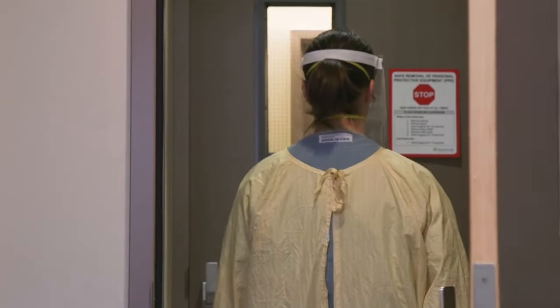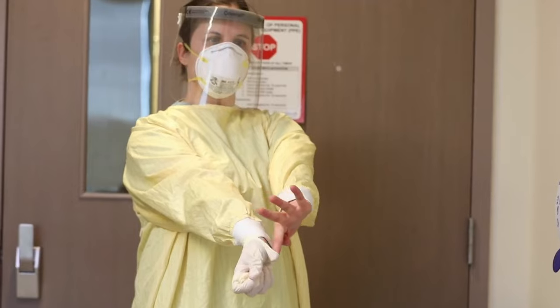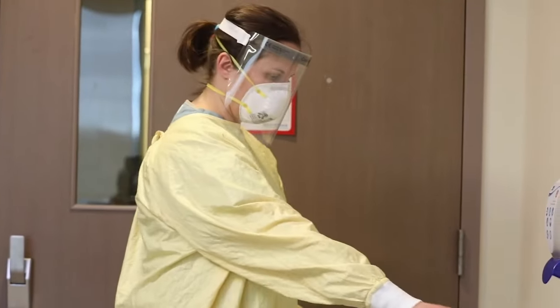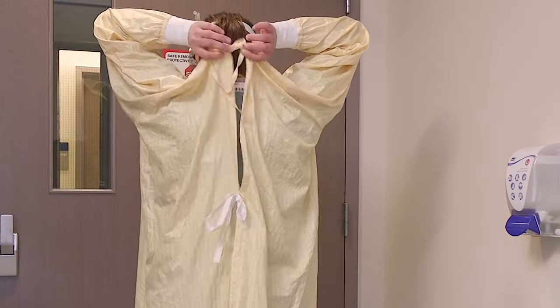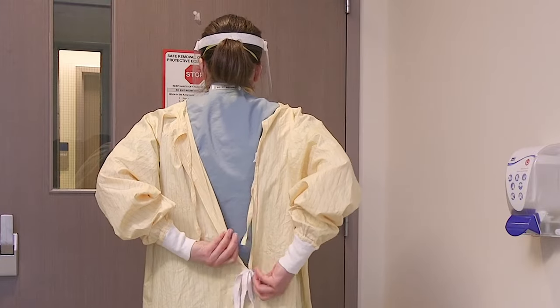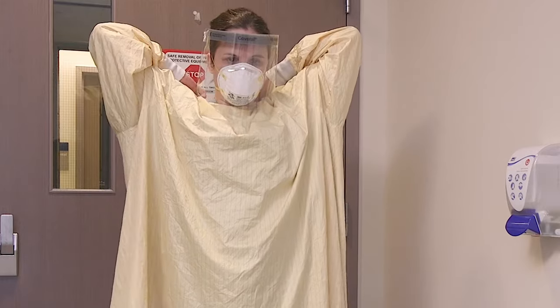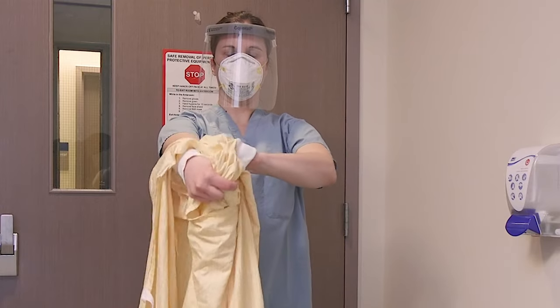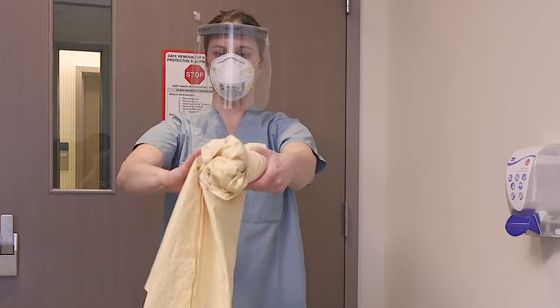Step into the anteroom and ensure the door is closed behind you. Remove gloves using the glove-to-glove and skin-to-skin technique and place in the garbage. You may perform hand hygiene at this time if there is any concern your hands became contaminated during glove removal. Next, untie the gown around your waist and at the neck. Grab the straps from the back of the neck and slowly pull the gown forward and peel it away from you, touching only the inside of the gown. Be careful not to let the gown touch your clothes. Roll the gown into a ball. Place the reusable gown in the laundry hamper. If you are using a disposable gown, dispose of it in the garbage.